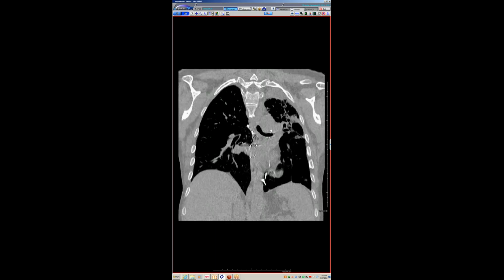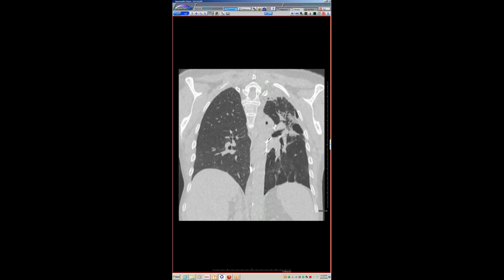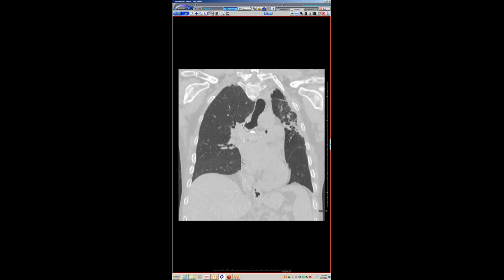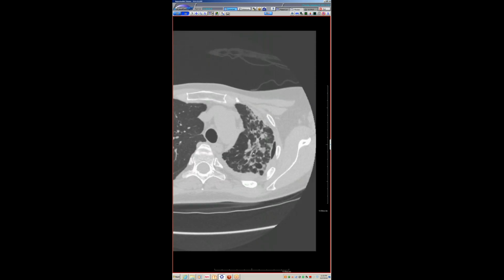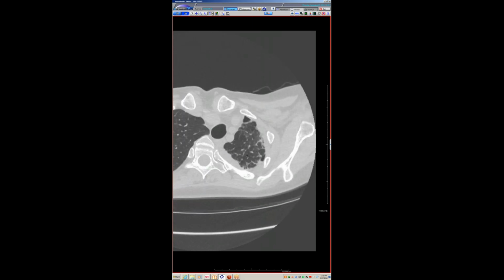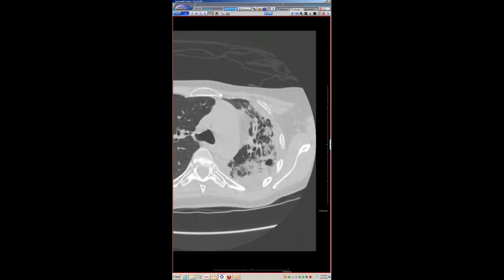Do you think this could be, I was talking about the clinician, he was wondering if it could be pleural parenchymal fibroelastosis in the left upper lobe, although I have not seen it associated with this kind of, in some areas, this kind of perilymphatic nodularity. So what do you guys think? That's kind of what I was thinking, Seth, as a possibility.